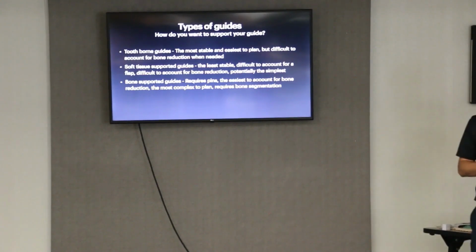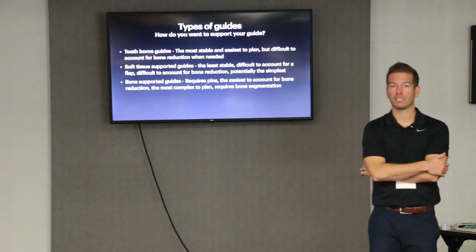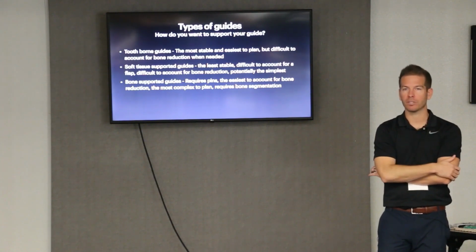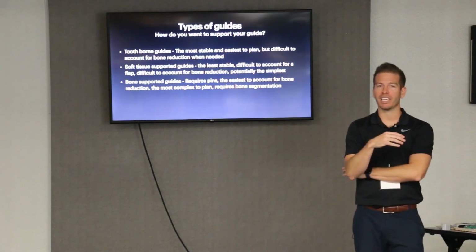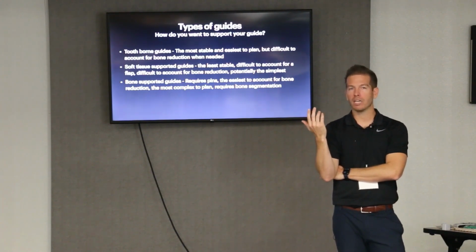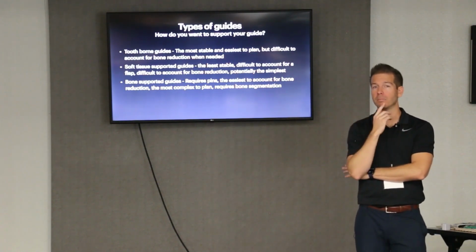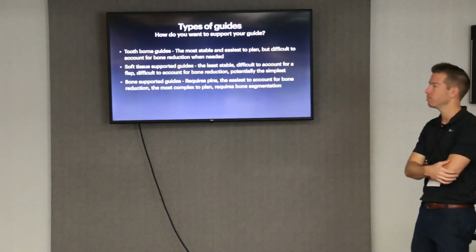So you definitely check mobility before, along with your smile and all that. Has that ever burned you? I haven't gotten burned on that at all with mobility, because generally those soft tissue floaters, you're just going to know, because it just came up in the exam or when you're planning the case. You can see a floater on an X-ray, and you just know, hey, I'm not going to anchor onto that. But pretty much everything else, as long as it's got some bone around it, is going to be enough. Those crazy floaters, I pass on those. But everything else, you'll be fine.